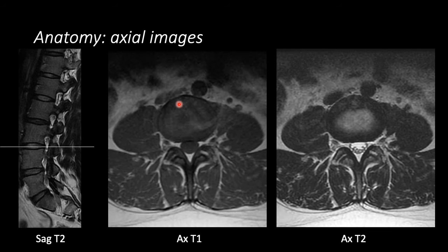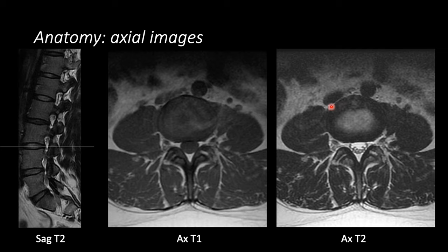Here we are at the intervertebral disc level. On the T1-weighted image, the disc is relatively uniformly intermediate in signal intensity. On the T2-weighted image, you can see that the annulus fibrosus is a little bit darker than the nucleus pulposus centrally, which is brighter.